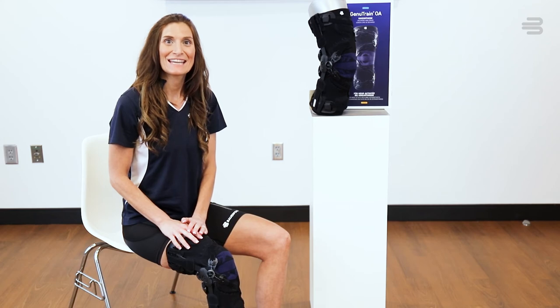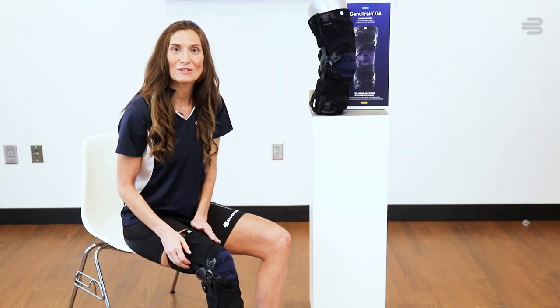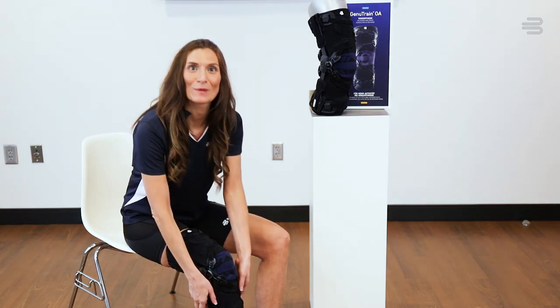To remove the brace, disengage the BOA system. Then use the two donning aids on the side to pull the brace down.